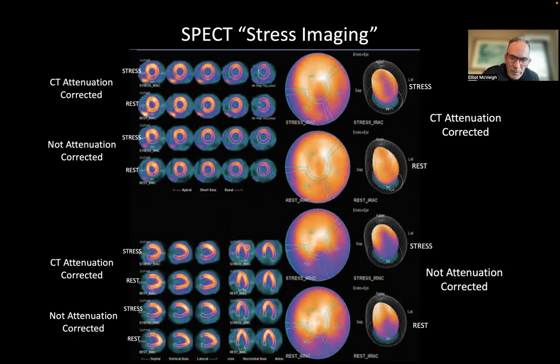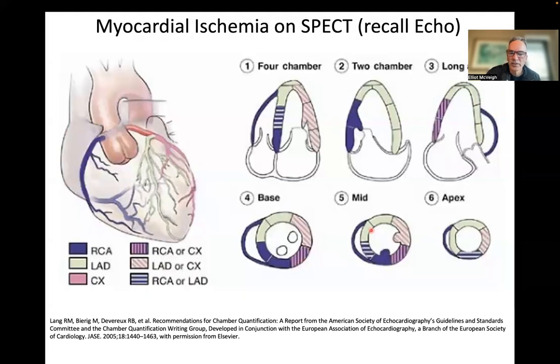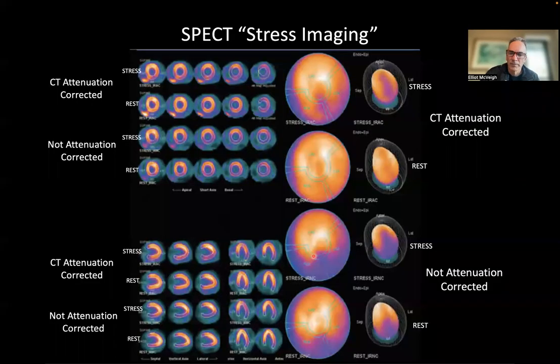Here's the septum and the lateral wall, and that's the RV over there. And so you can post that up as a bullseye plot, which is essentially this coordinate system here, right? In the inner ring of the bullseye is this data, mid ring is this data, and the outer ring is this data. So when we go to that bullseye, that's what that looks like.